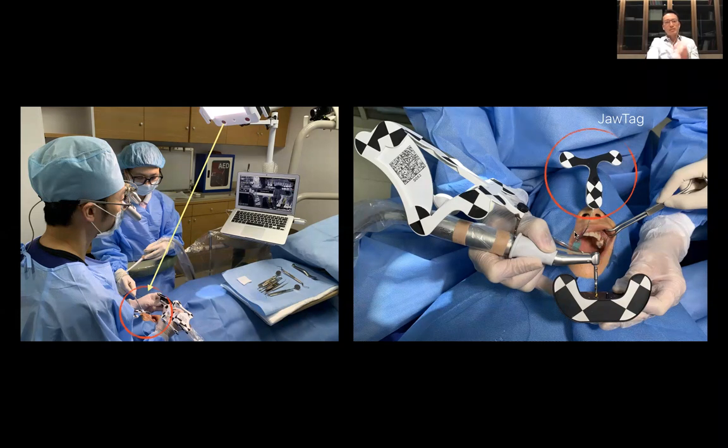Okay, so the camera first needs to see the jaw tag, and then the camera needs to see our instrument here. We attach a drill tag to our handpiece, and this handpiece could be a contra angle, a high-speed handpiece, a piezo surgical handpiece, or a straight handpiece. So pretty much any instrument you want to use, you can attach the tag to it.